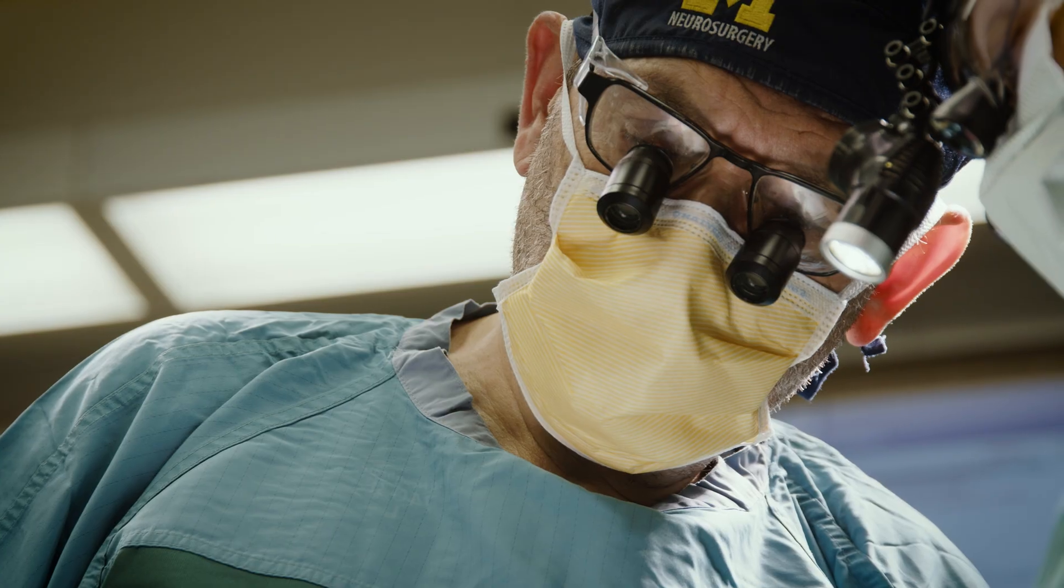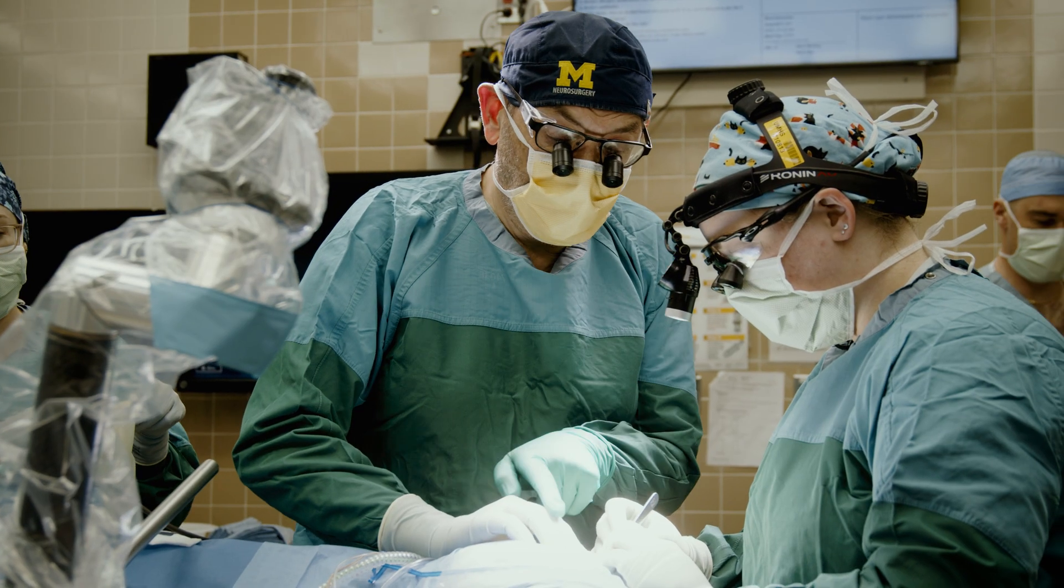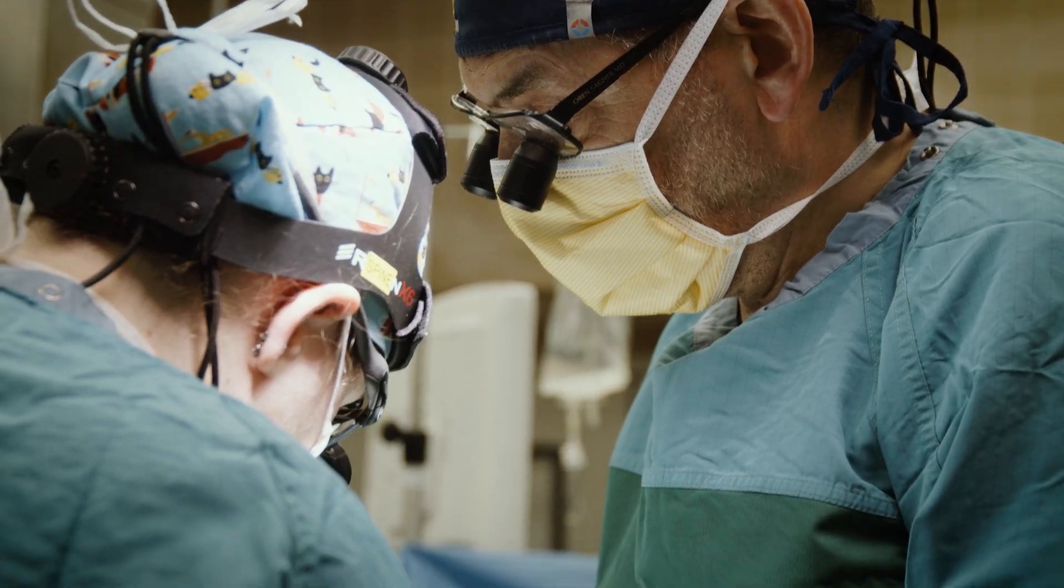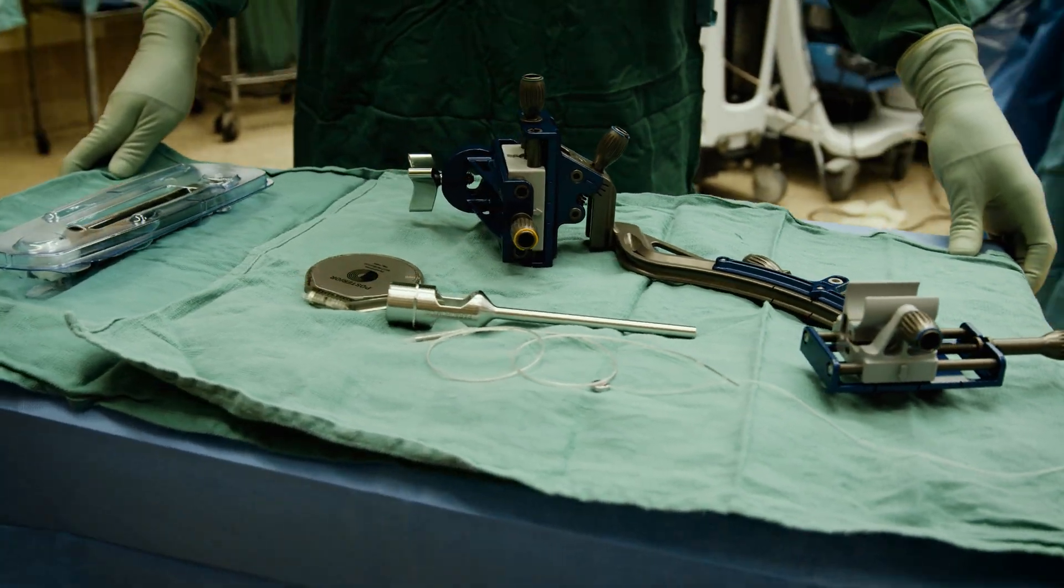The procedure that we're doing for this particular patient is removal of a portion of the brain that's causing seizures. Prior to removing that area of the brain that's causing the epilepsy, we're placing a chip temporarily on the area of the brain that we're going to be removing.